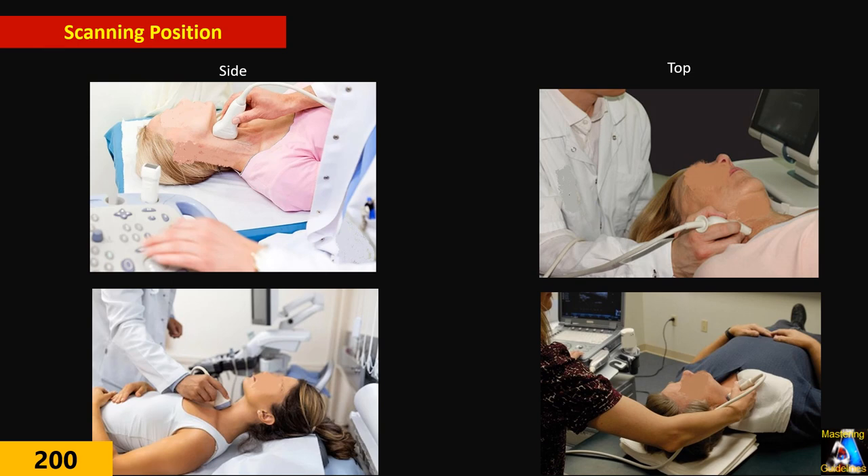For scanning of the carotid, we have two types of scanning — one on the side and another on the top. With the side technique, the problem is that you have to anchor your arm and forearm on the chest of the patient, and many patients are not comfortable with that. Second, for the other side, you usually have to extend and expand your arm, increasing the angle and abducting too much, which will cause problems long term. Even if you use this technique, try to fold a towel under your forearm and wrist so it doesn't press on the patient.